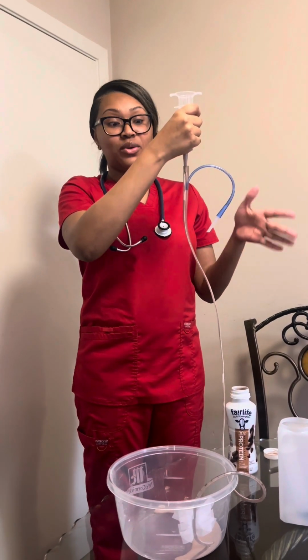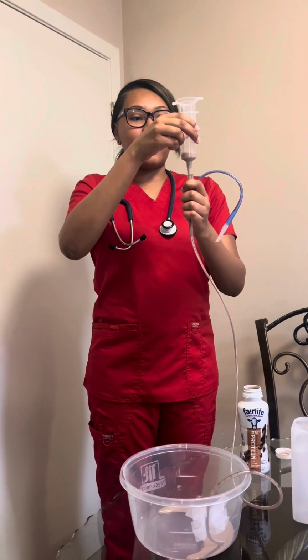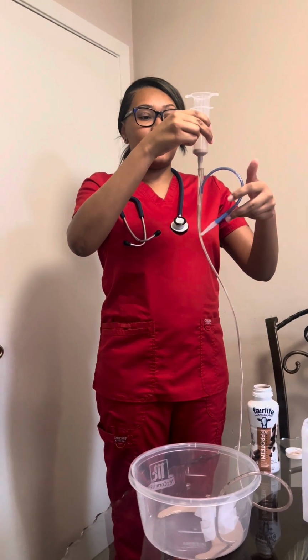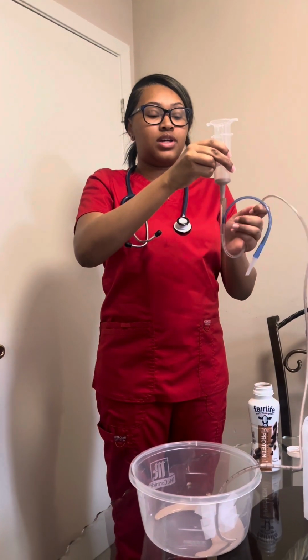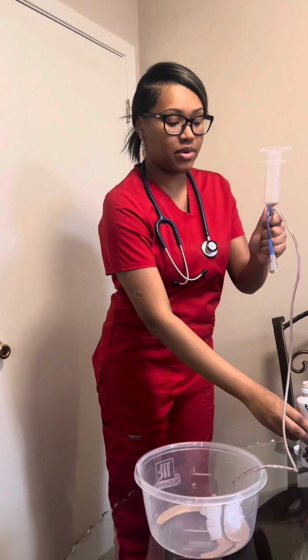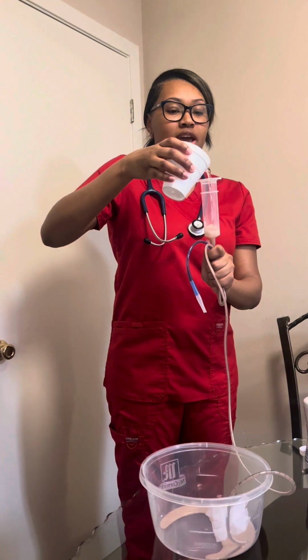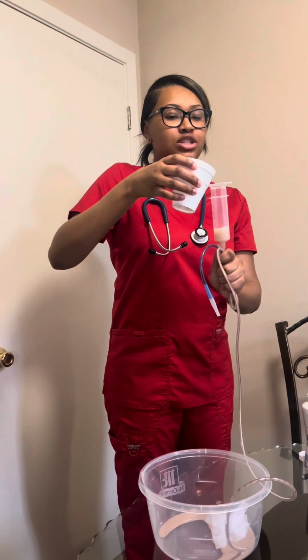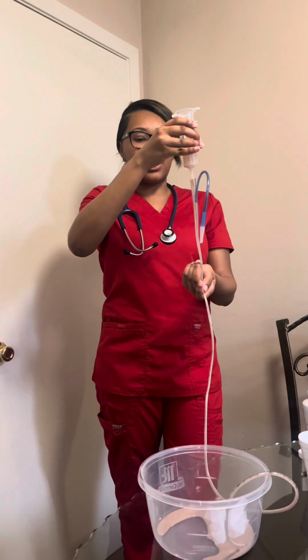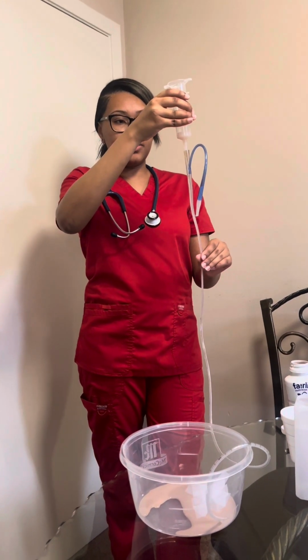And I will continue to do this until I have administered the amount that was prescribed to the patient. And I'll just let it flow. And before it gets too low, I do not want to put any air in the patient's stomach. So then, once I have given the patient the right amount, I would add a little water to flush the tubing. I would do 50 to 100 milliliters, and I would just let that flow in to clear the tubing.